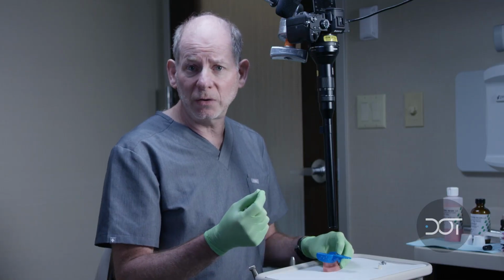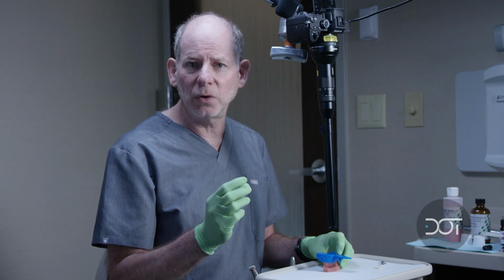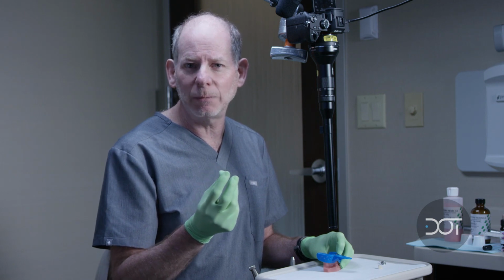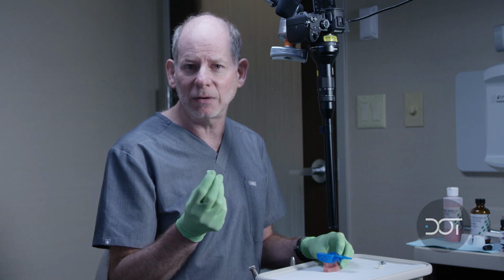My advice to you would be to oversize your hole a little bit. If you have too small of a hole, when the impression tray is filled with the putty material or your impression material, it can be difficult to gauge exactly how to put in that impression tray. And you don't want to be spending too much time trying to get the impression tray moved around, trying to find that hole for the pin to come through. So make your hole a little bit bigger than what you think you need. So there's a little wiggle room, a little space to be able to get the impression pin through the tray.